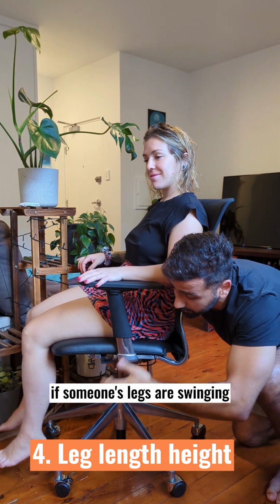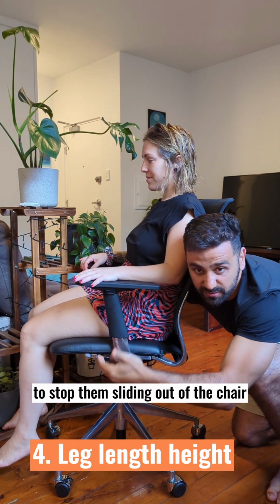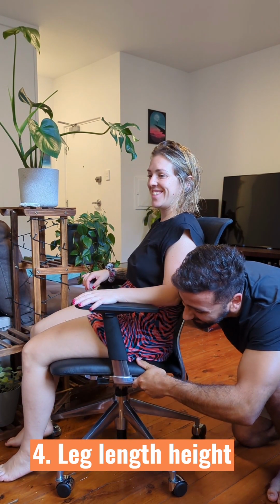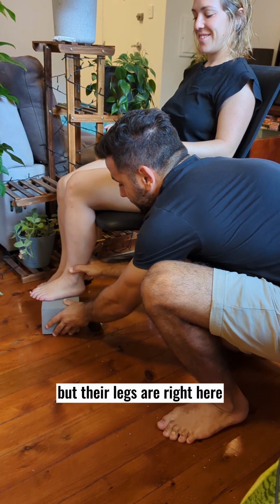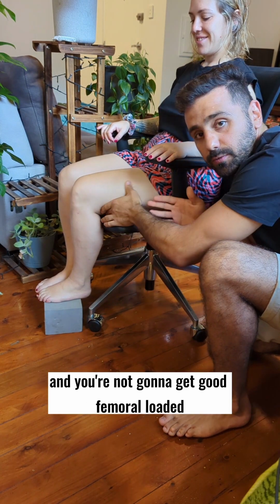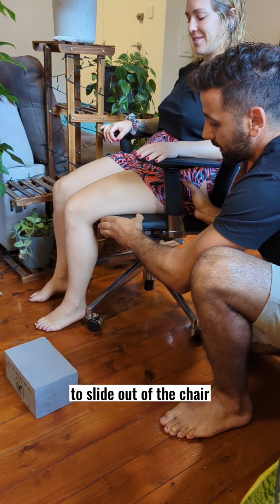Number 4, adjust the foot plate height. If someone's legs are swinging or even if they're only just touching the foot plate, they don't have any pressure pushing them back to stop them sliding out of the chair. So what you want to do is make sure you lift the foot plate up high enough that their legs are right here. Too high and you're going to have some space under here and you're not going to get good femoral loading, and too low, they're going to have a tendency to slide out of the chair.